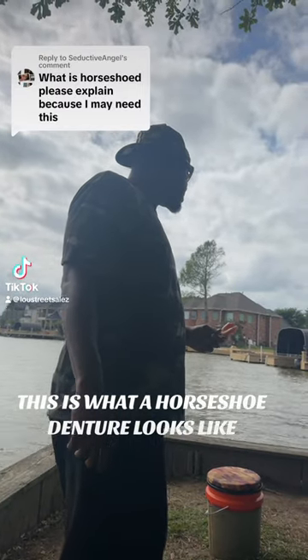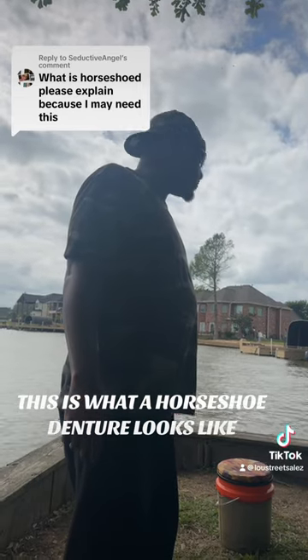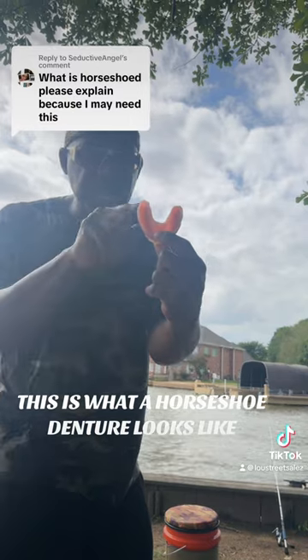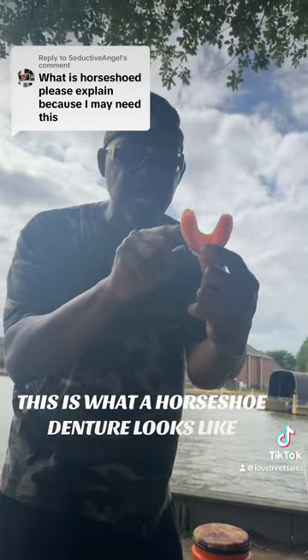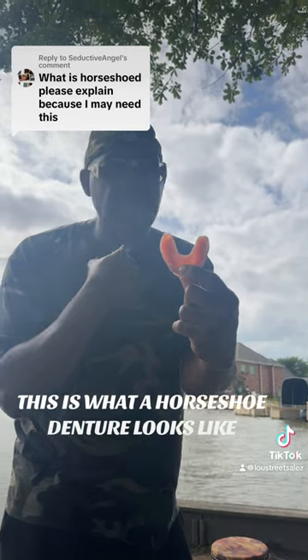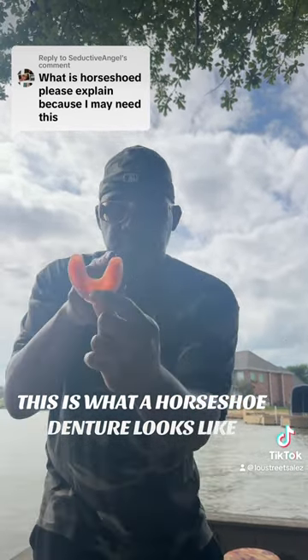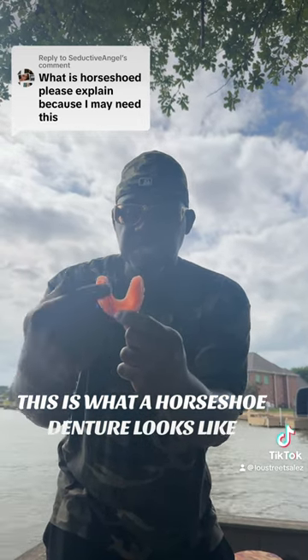Someone asked: what is the horseshoe? Just the top denture — when you get the top denture, it has a big suction that hurts your throat, you can't swallow. But when you get it like a horseshoe, with the U shape in there, you take this where you get your taste, right up in there.